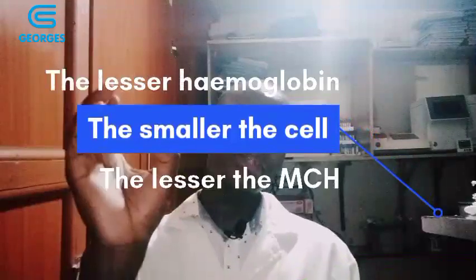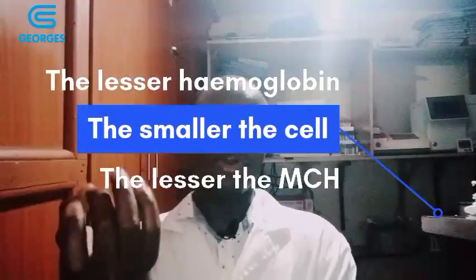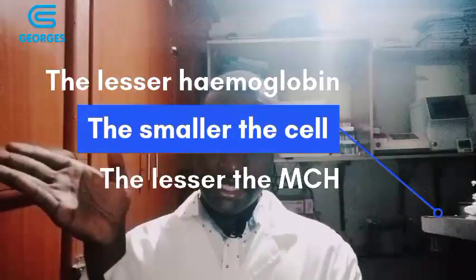When the cell is small, it means that it will not be able to accommodate a large amount of hemoglobin because it is small. So when the hemoglobin is small, this will also translate to a smaller MCH. So the reference range is 28 to 34 picograms. Actually, a picogram is a trillionth of a gram.